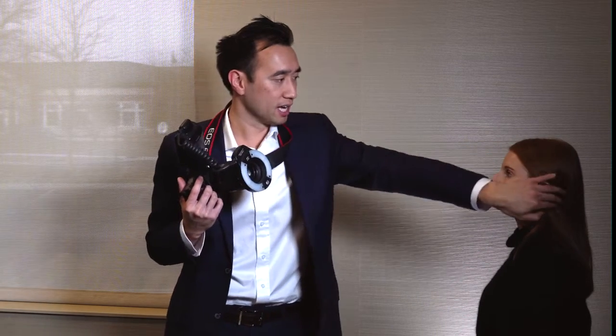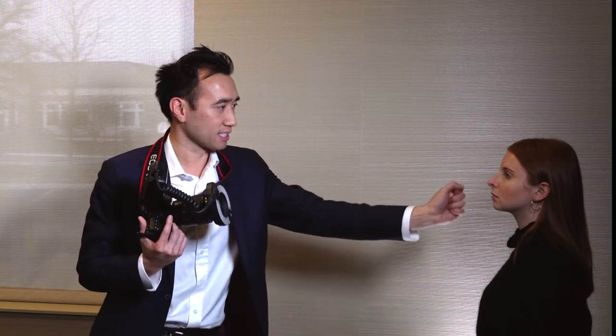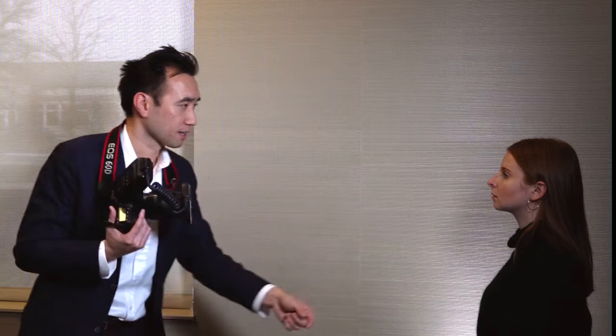When I'm looking at Becca I'm going to make sure that I'm framing the shot slightly below her chin and slightly above her head. For those going through the AACD accreditation process it's really important that we have it horizontal. When I'm taking her photos I'm going to have her put her hair behind her ears. This allows me to see both sides of her face to make sure that I have an even amount on either side and I'm shooting from straight ahead. I can notice I see more of the right side ear than the left, so I'm going to have her turn a little bit and move back until I can frame the shot.